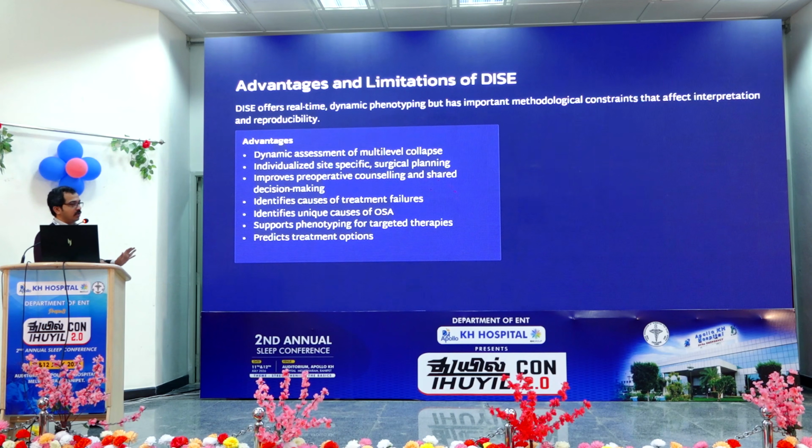Let's see what the advantages and disadvantages are. I have discussed all the advantages, like dynamic assessment of multiple collapses. It helps in planning individual patient-specific, site-specific treatment. It improves preoperative counseling. You can show the records of the DISE and discuss with the patient. It identifies the causes of treatment failures, and identifies unique causes of OSA like sleep-dependent laryngomalacia. But one thing we will miss is REM-predominant OSA, because through DISE we are not able to replicate REM sleep. And it supports phenotyping for targeted therapy and predicts treatment outcomes.